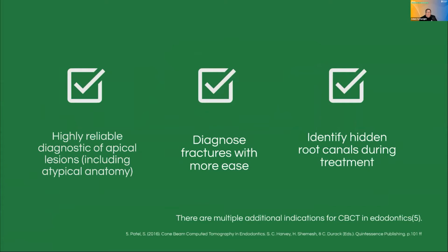Now, the third key one, which comes up on a number of studies, is obviously being able to identify the hidden root canals during treatment.